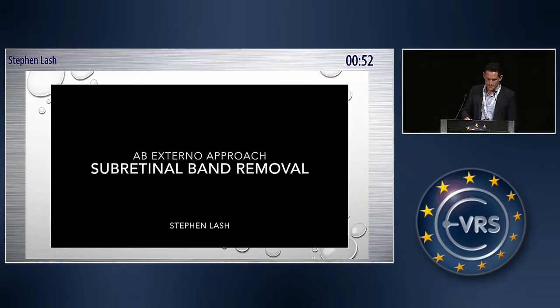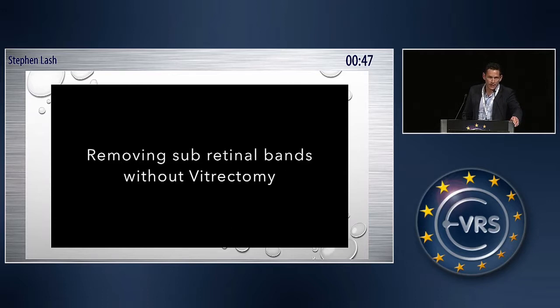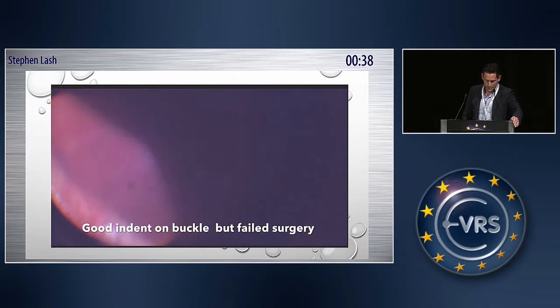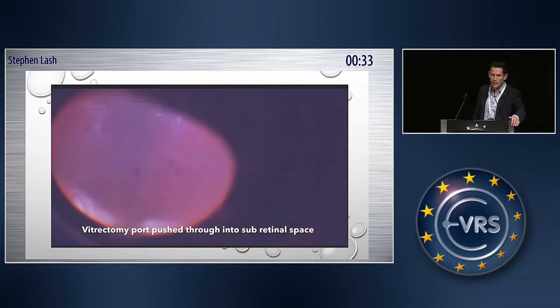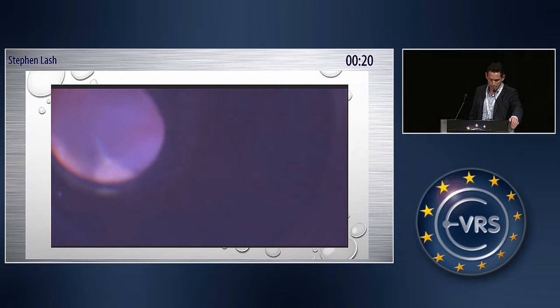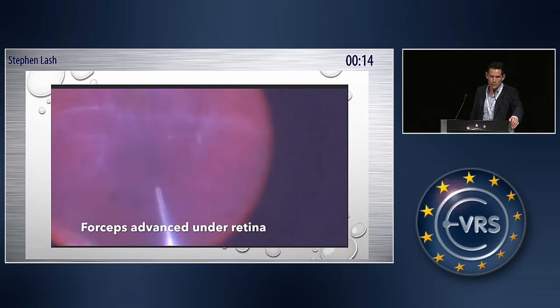But this is what you want to see, really. So we see that there's a wonderful indent — it was a perfectly executed buckle, in my opinion. Good indent, good pexy, failed. So you see the trocar being pushed there. It's a very different feel, and it's very soft. You're aware that you're in quite a tight space, and you'll see the tip come through now, and then just gently rotating and pushing, trying not to go through choroid or retina. There's the port in position. I initially started with ILM peeling forceps, but they were rubbish.